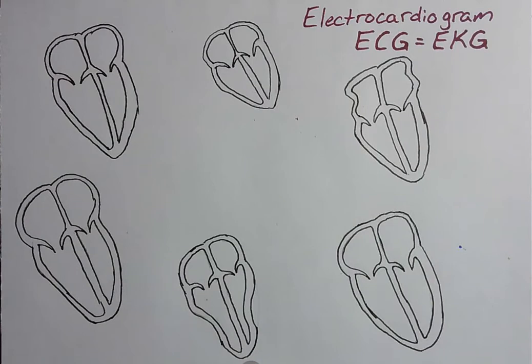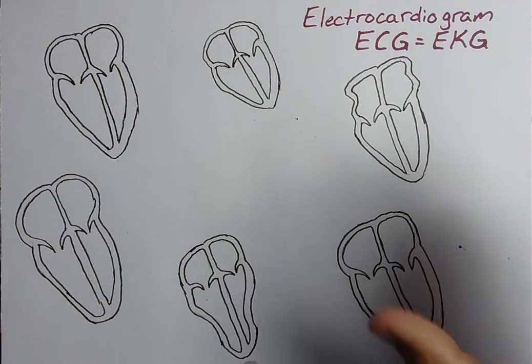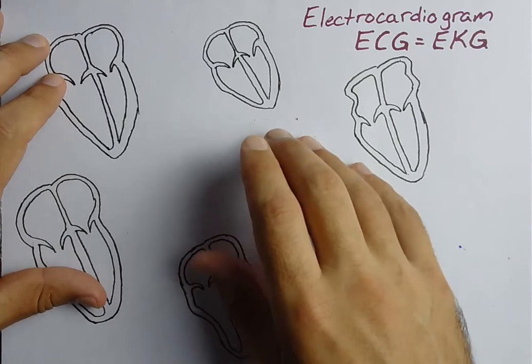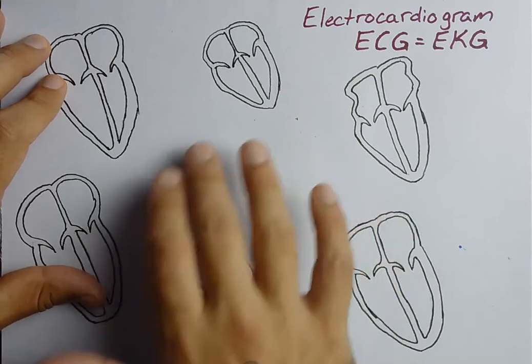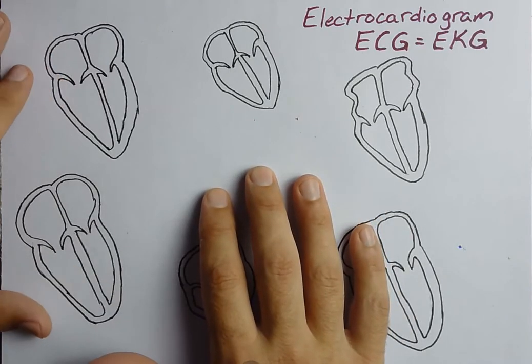So an EKG, what I recommend that students do first and foremost is understand what an EKG is actually a representation of. An EKG is, in essence, electrodes placed on a patient's body. They're going to put electrodes on the right wrist, the left ankle, and then a myriad of other places on a patient, depending on how many electrodes there are.